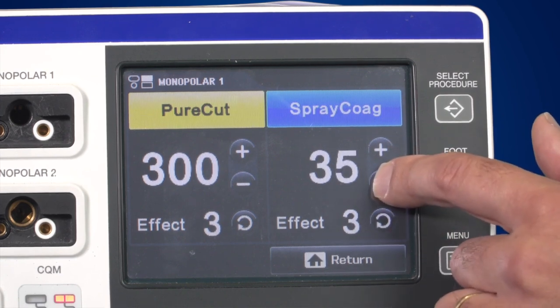You can also change the effect setting. If the output power is too high or too low, changing the effect setting is the first step you should take to adjust the output power. You can then fine tune it further using the plus and minus buttons.